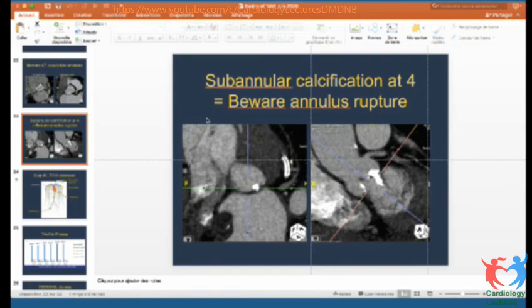Yeah. So in my practice, if there is a lot of LVOT calcium, like the case which Syed showed, such cases I would avoid balloon expandable valves. And like you said, if you have a very small annulus diameter, like your annulus is about 18 or so, those cases I would probably prefer a self-expanding technology. Otherwise, the other cases I would discuss case by case and choose the valve.